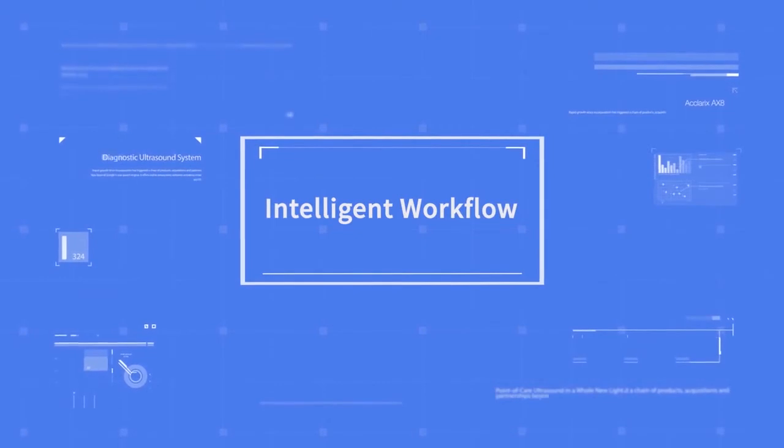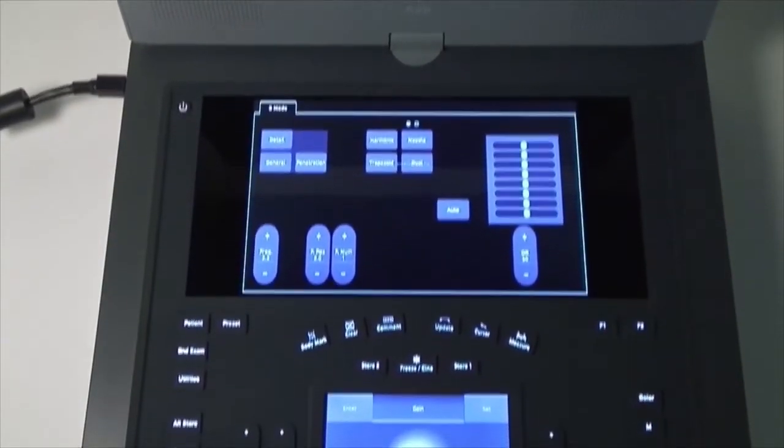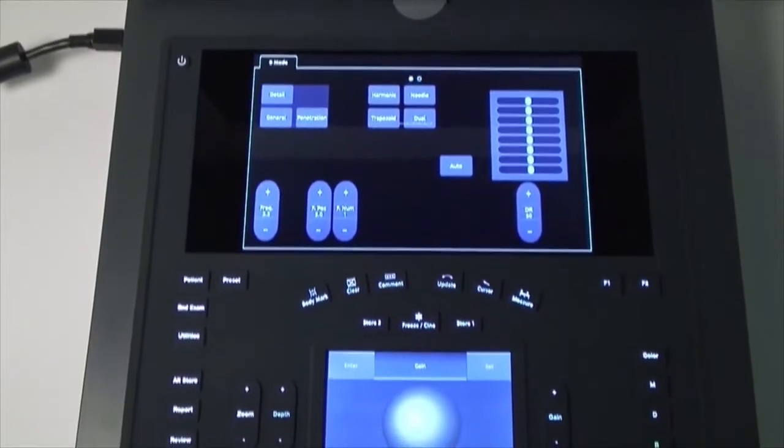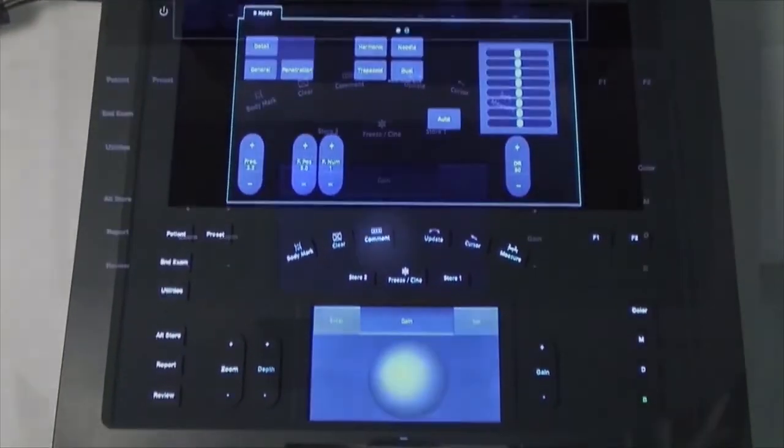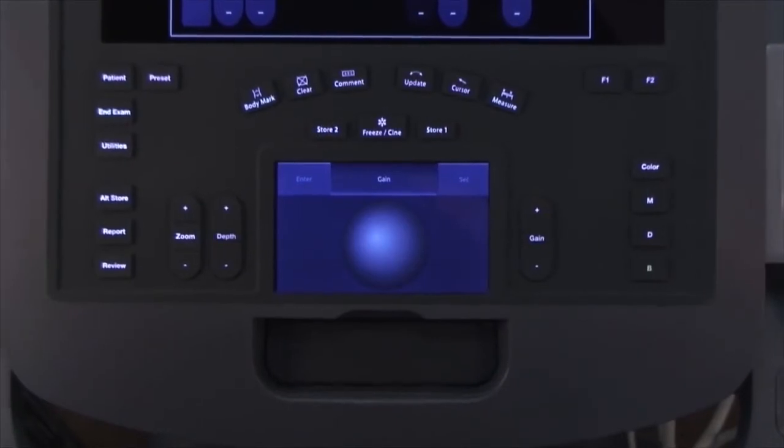The next area of excellence is intelligent workflow. The dual touchscreens simplify workflow and set a new standard for flexible user interface. We believe this unique design will set a new standard in workflow and user customization.